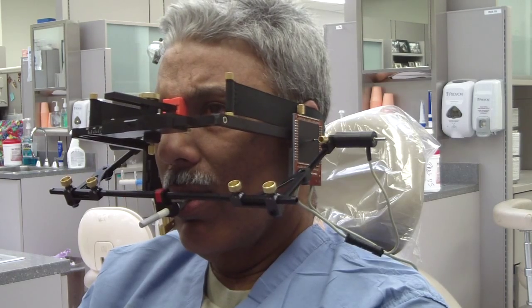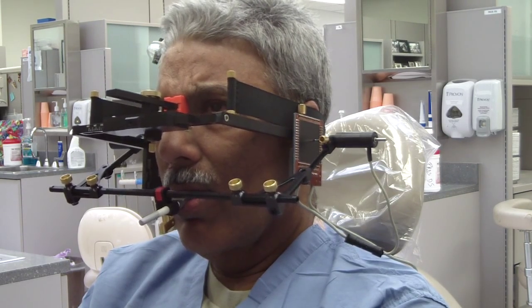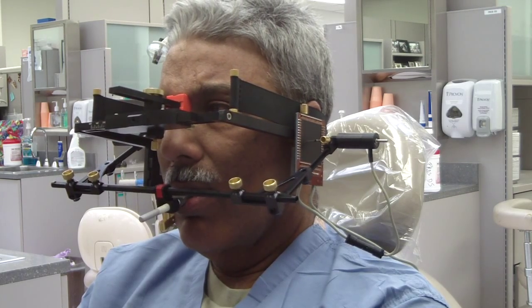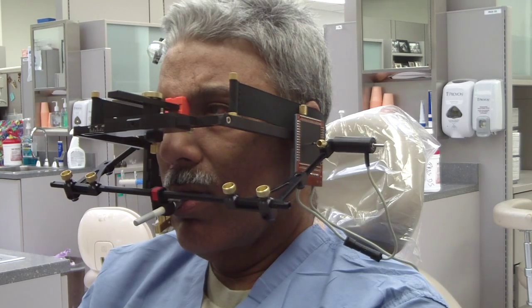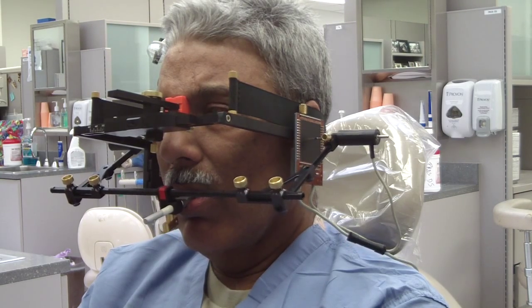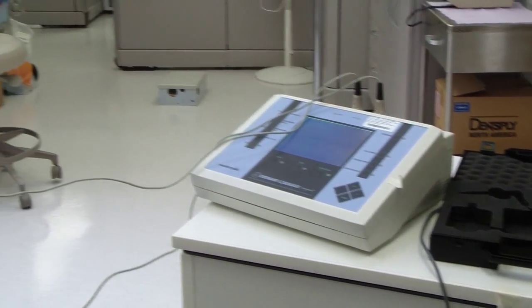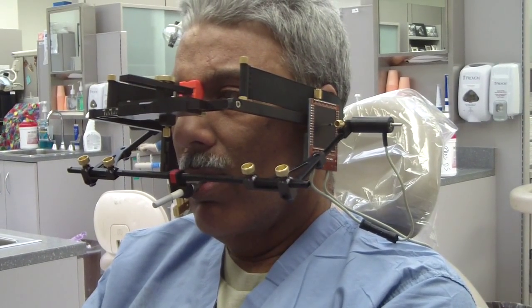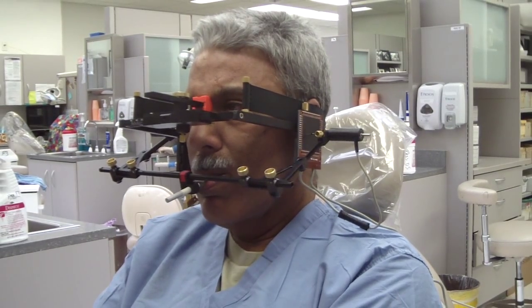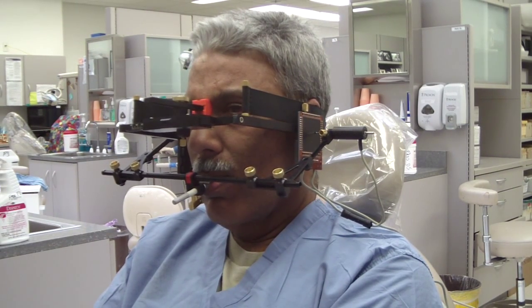The conventional pantograph tracing is also a good device, however that introduces more errors. This digital unit will instantaneously register the information onto the computer — like a CPU — versus the other one, the D5 pantograph tracing, which is a more mechanical device and introduces a lot of human errors. The more gadgets to play with, the more errors they produce.